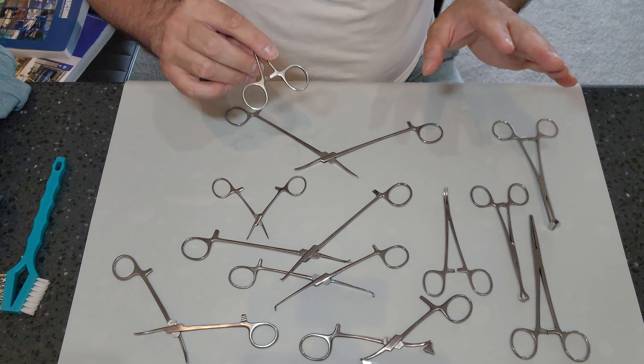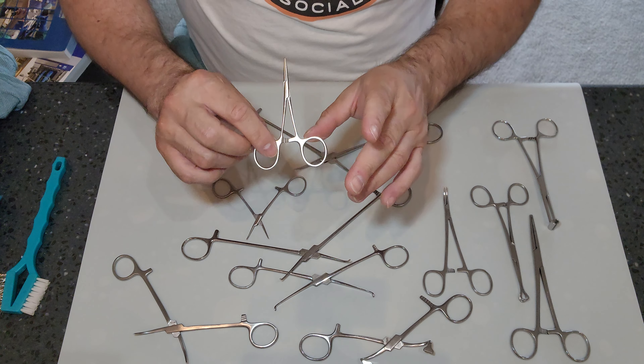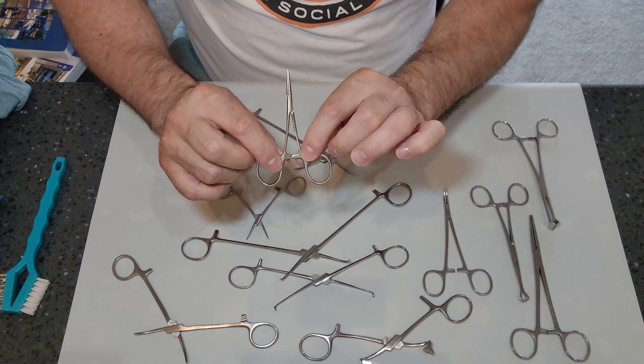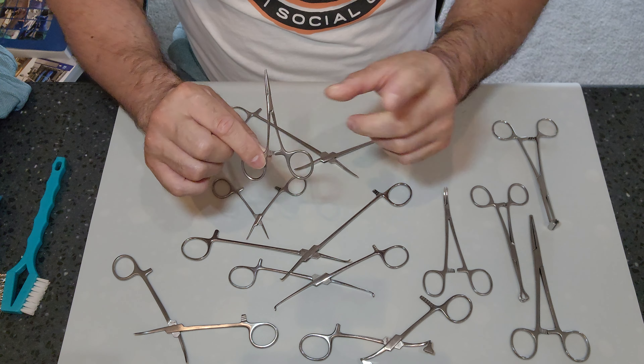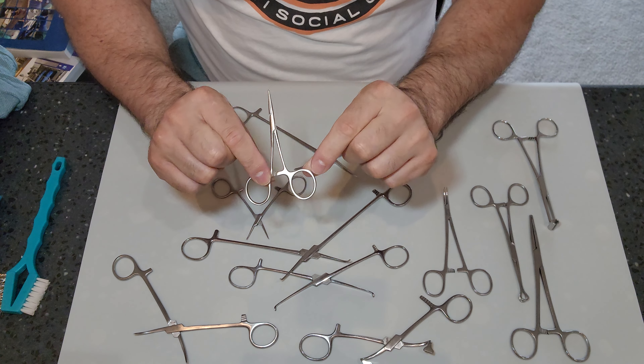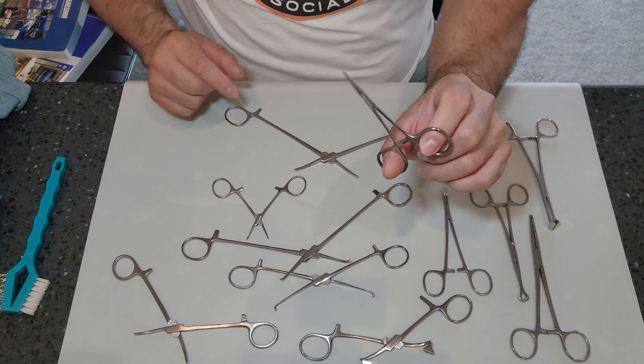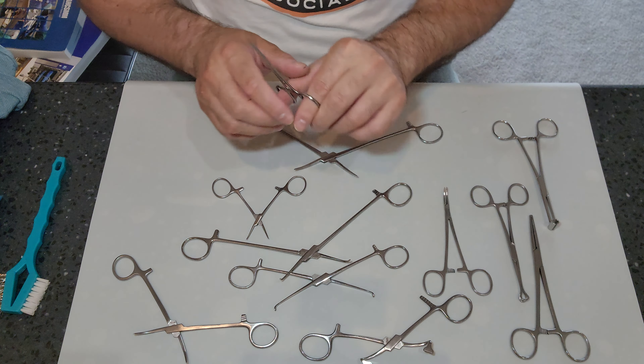Importantly, not all of them have them — some of the dissectors don't — but most clamps, meaning instruments that clamp shut, have a ratcheting mechanism. Whether that may be an interlocking one or one with a little lever, there is a ratcheting part of the instrument.